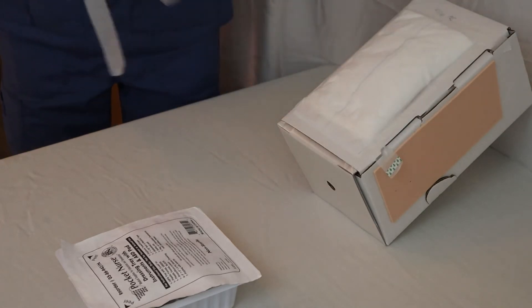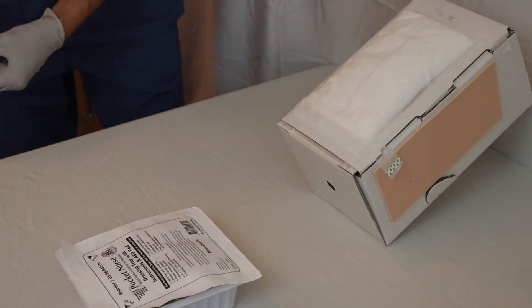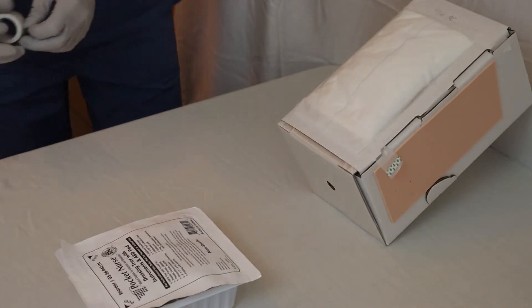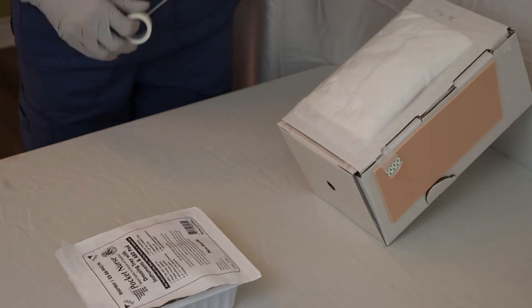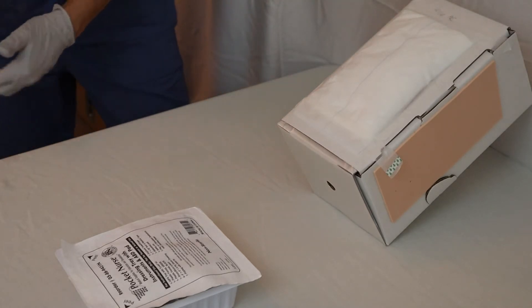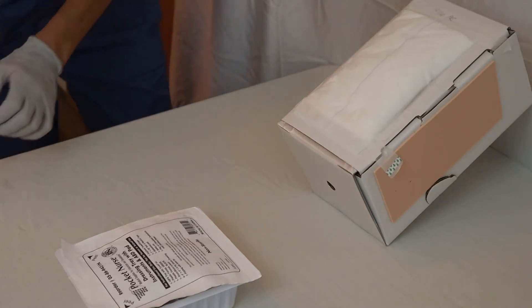Typically, we want to form a window frame around the dressing, which is what I'm doing here because this dressing was set up the same way before.